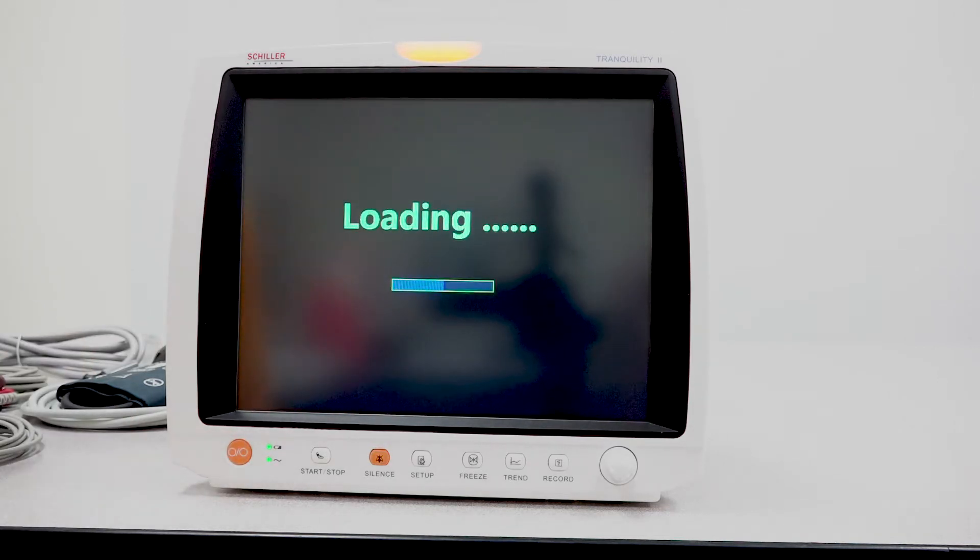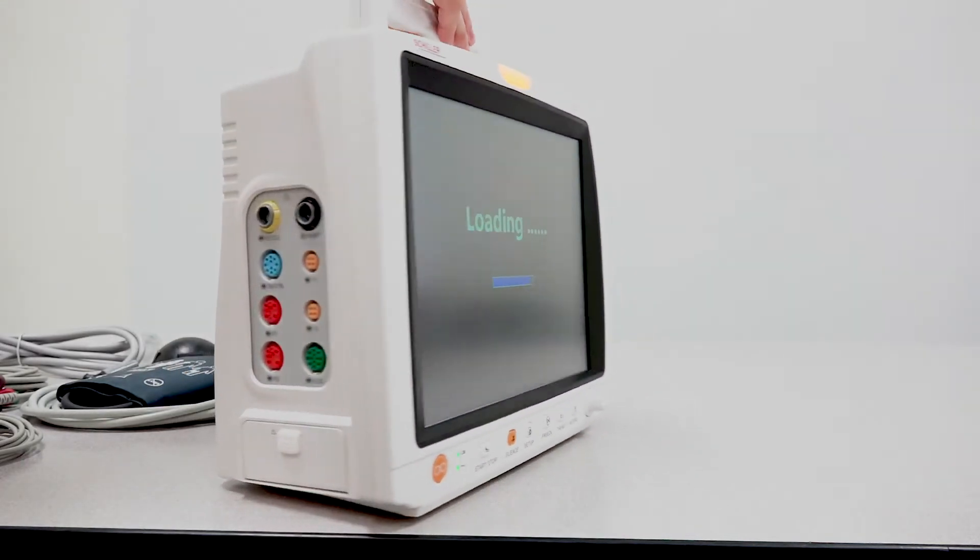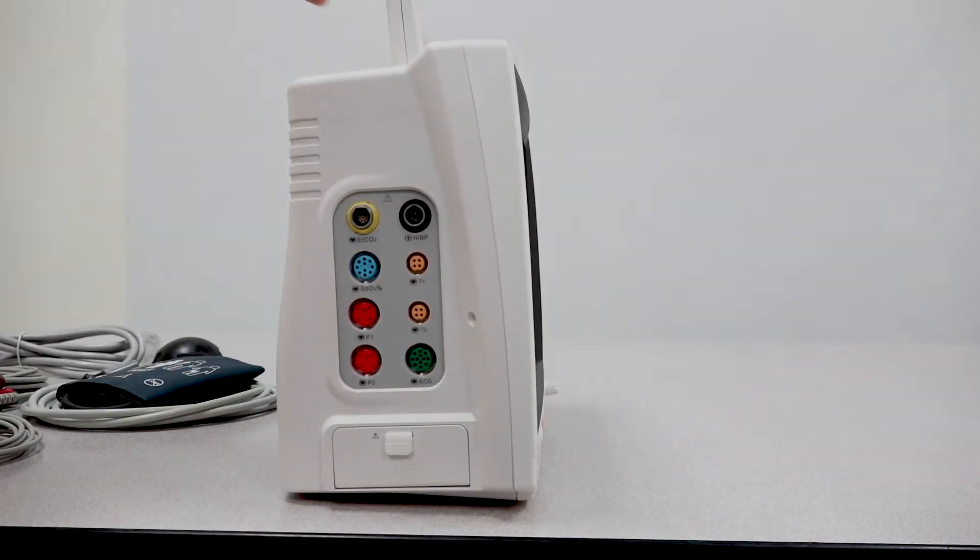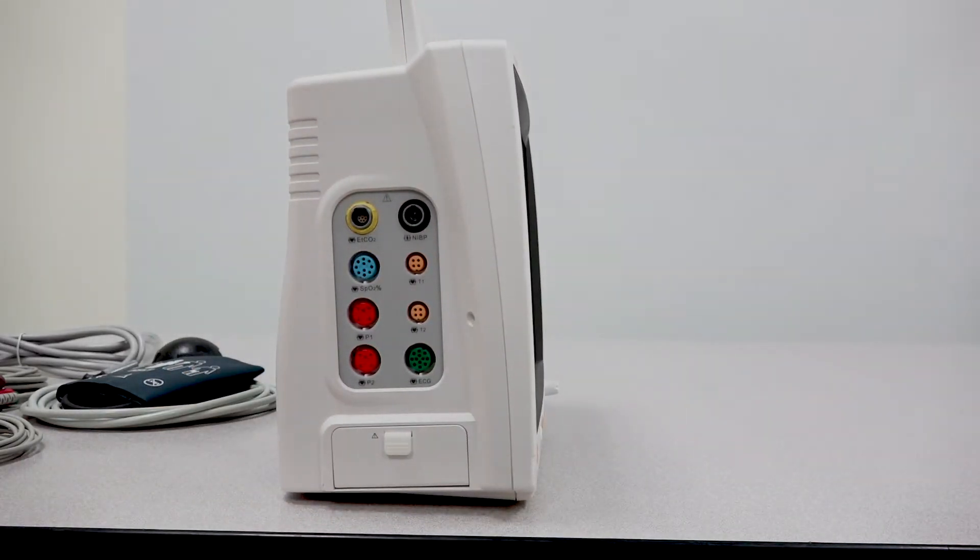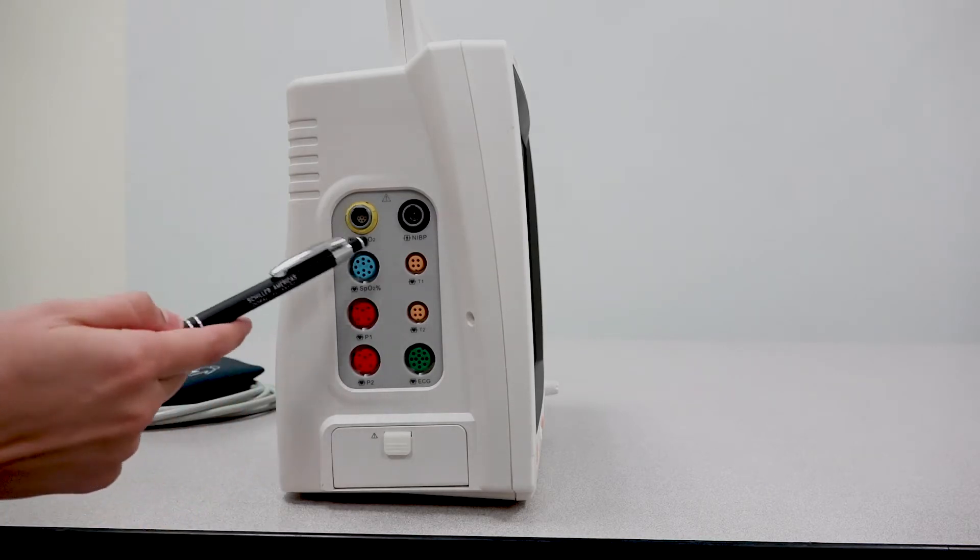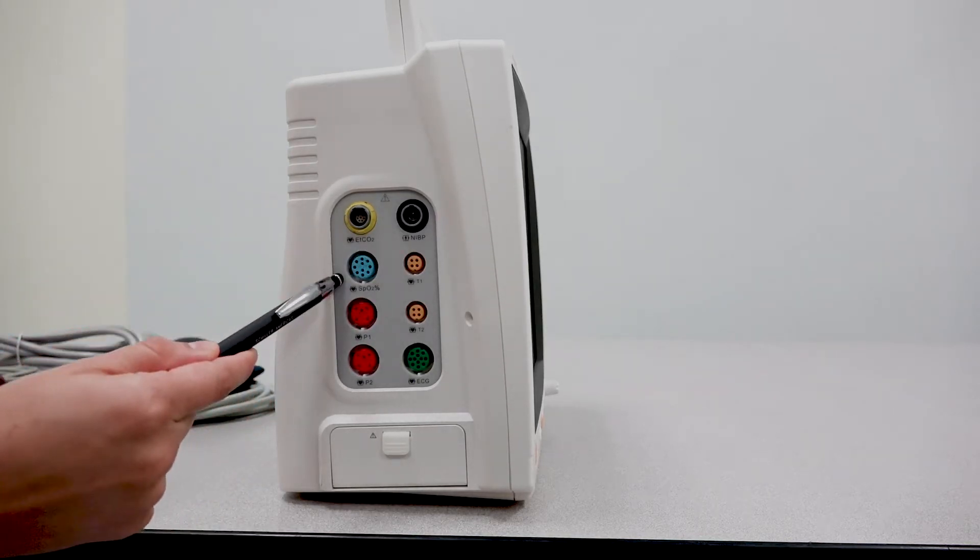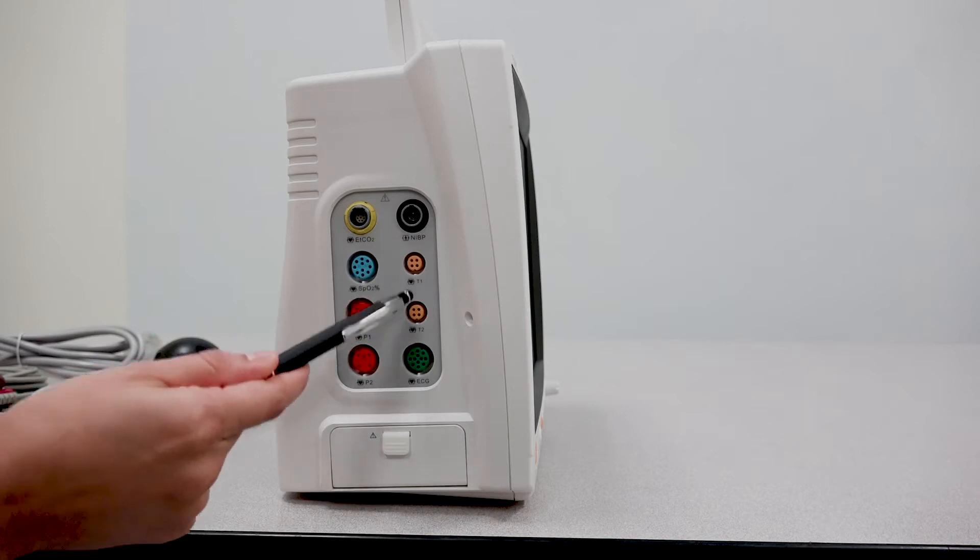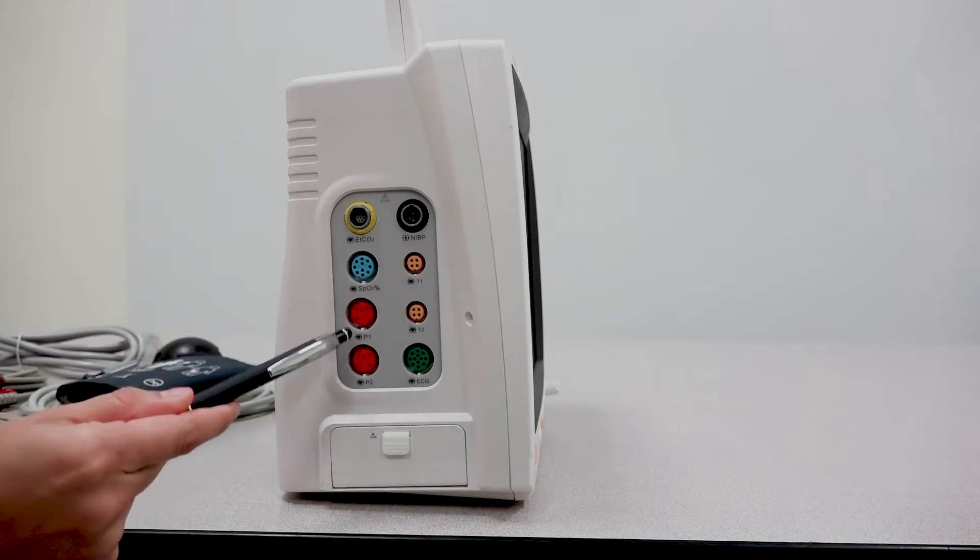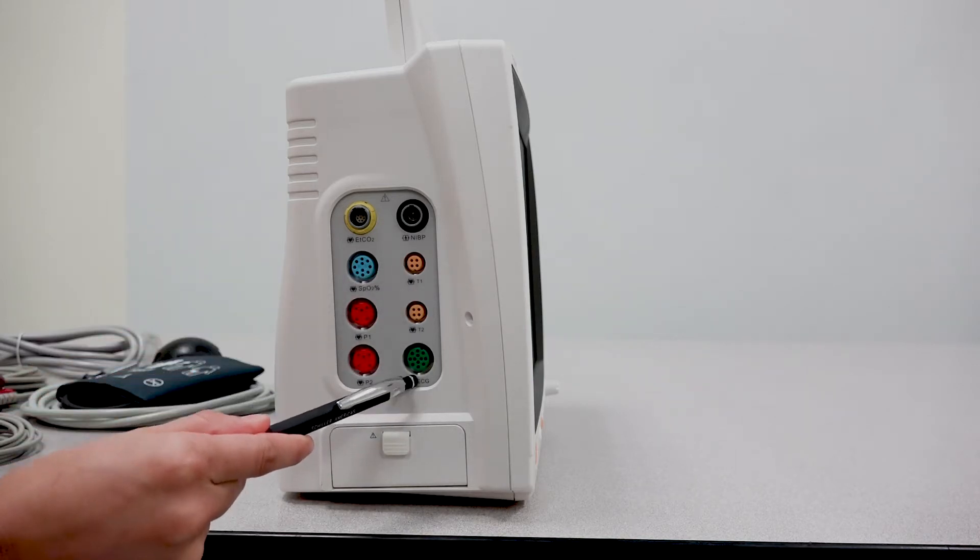One thing I want to point out are the parameters that this unit comes with. If you notice here you'll find your different parameters: entitled CO2, NIBP, SPO2, 2 temperature parameters, 2 IBPs, and an ECG port.